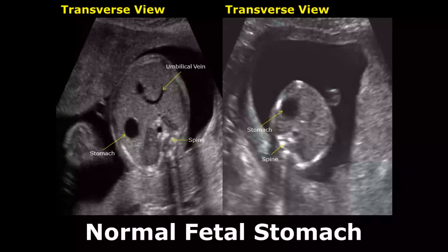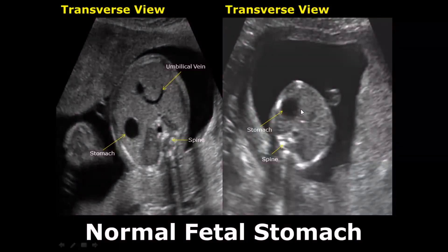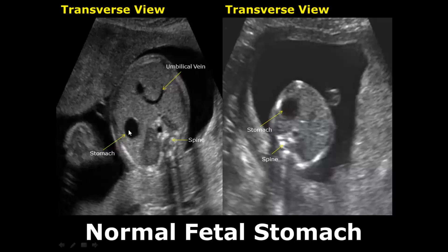The stomach can be visualized around 13 to 14 weeks. It is usually anechoic because it is fluid-filled and has various shapes and sizes. We can see the stomach at the level in which we see the umbilical vein. Here you can see the umbilical vein, and over here you can see the stomach. This is a good level to locate the stomach.